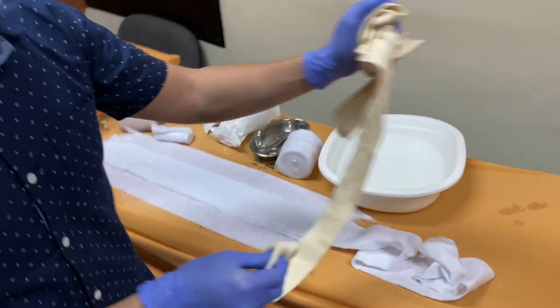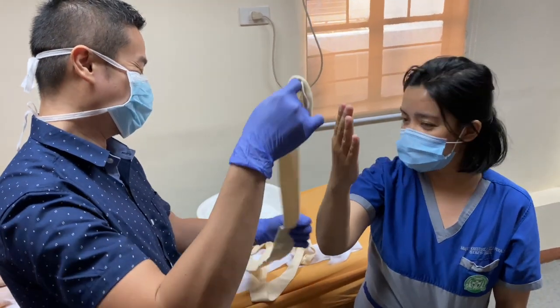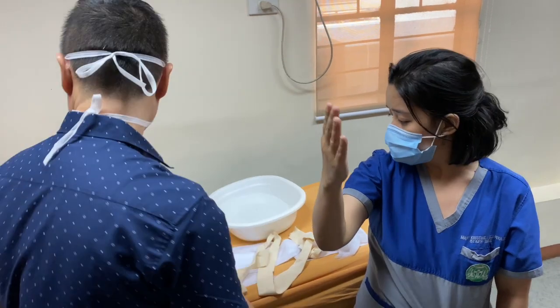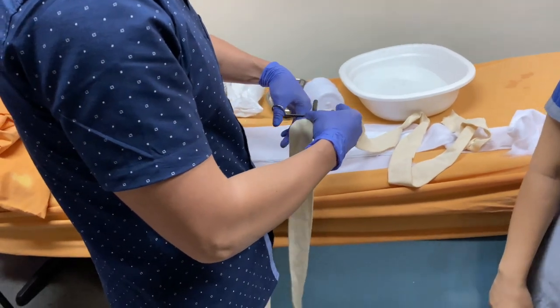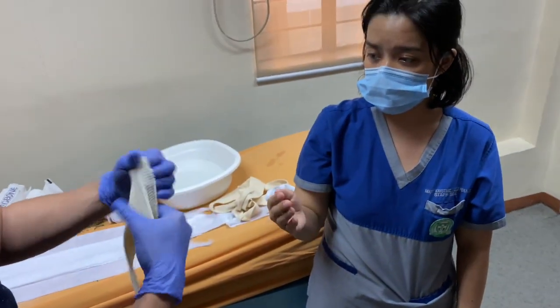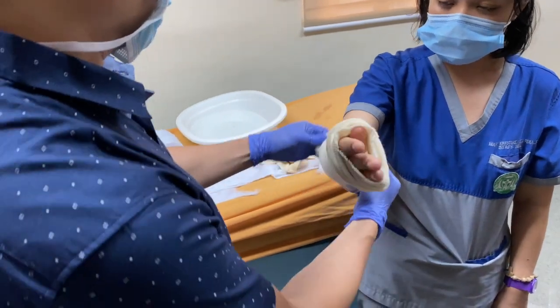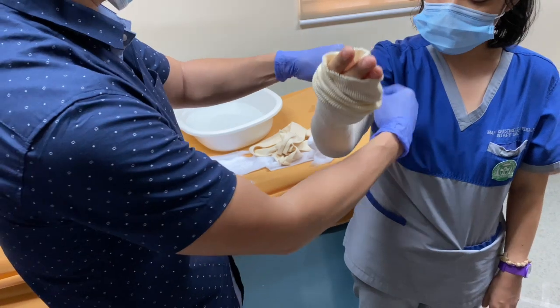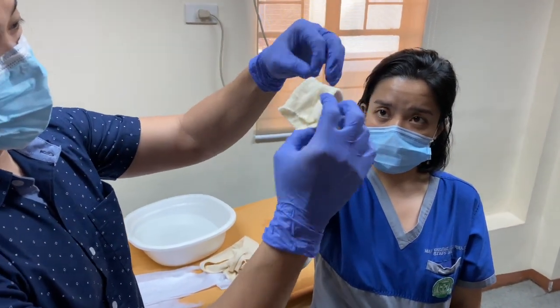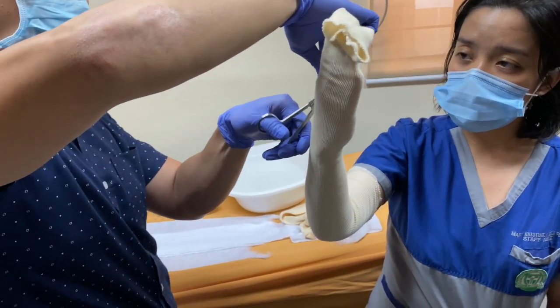We need to prepare the limb. We put on the stockinette. Usually add around 2 to 3 inches from the edge of the skin that we'll be applying. It's a bit long, but you can pull this down a little bit later. Then you can create a hole for the thumb — be careful not to cut the skin.